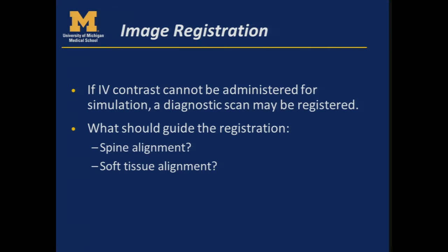So what about the scenario where IV contrast can't be administered? So you have a diagnostic radiology scan in end inhale position, and you have a CT simulation scan in end exhale position. So how would you guide the registration? Do you do spine alignment? Do you do soft tissue alignment?